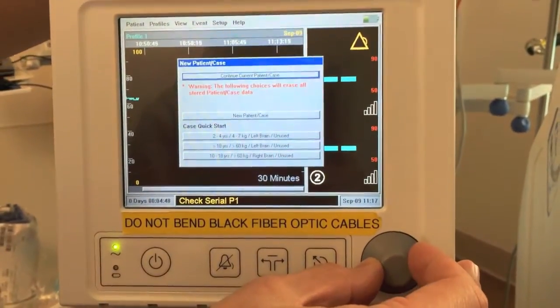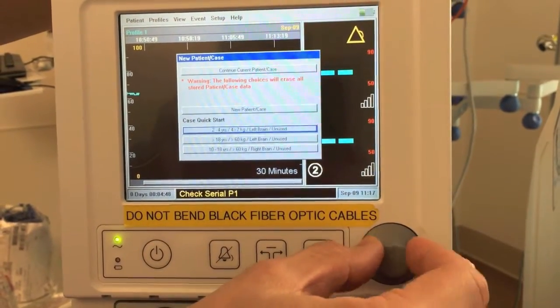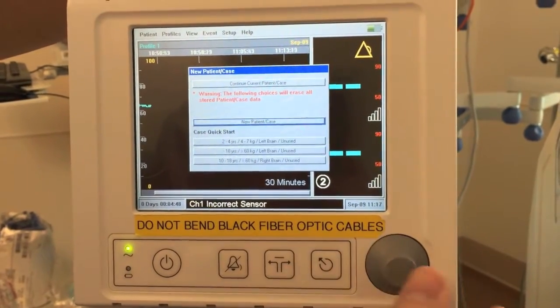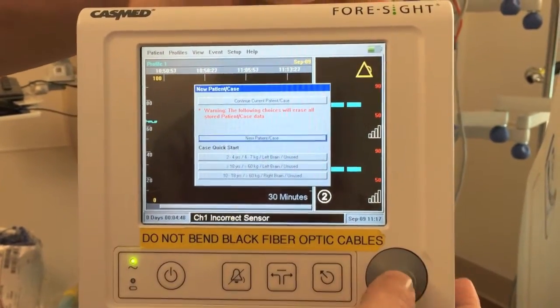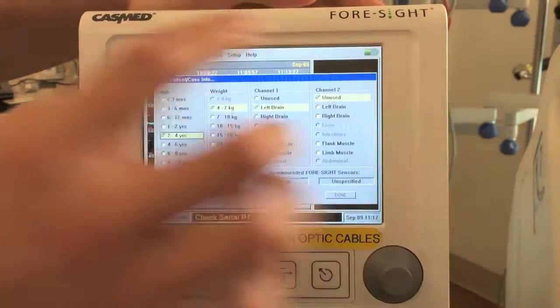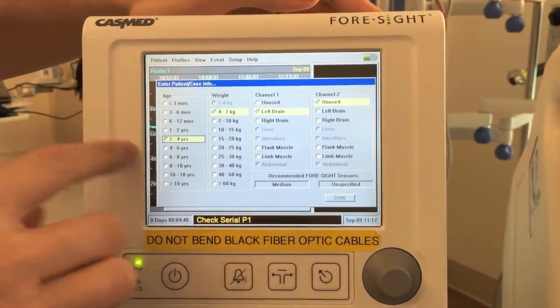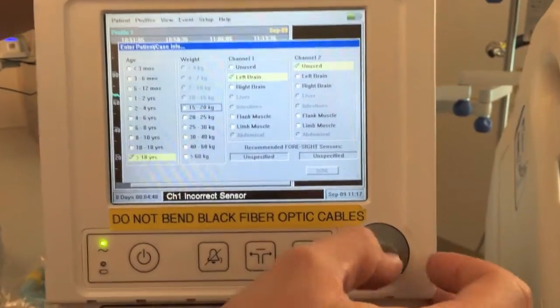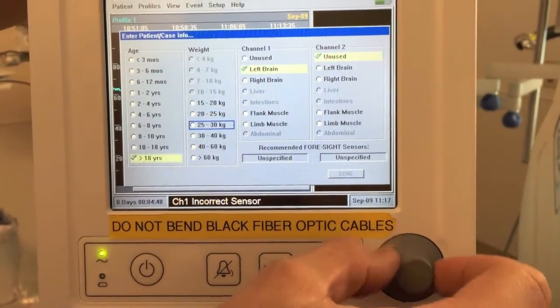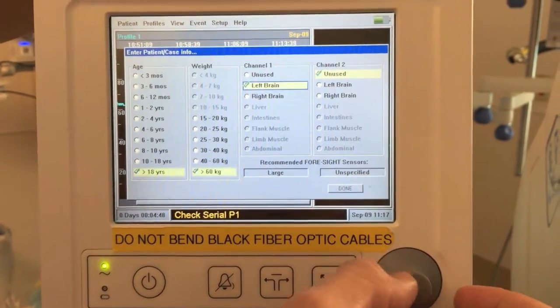You use the toggle switch to scroll through your options and then press the toggle to select. We're going to select a new patient case, which brings you to where you select the patient's age and weight. Today we have a patient who's older than 18 years, so we use the toggle switch to select that and then greater than 60 kilos.